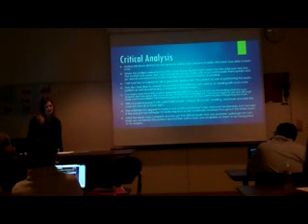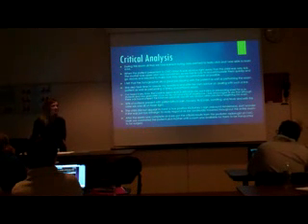I chose this exam for several reasons. I felt that the appendix can be intimidating to us as students as well as new graduates because we haven't seen that many. I had seen a couple but never a positive one until this case.